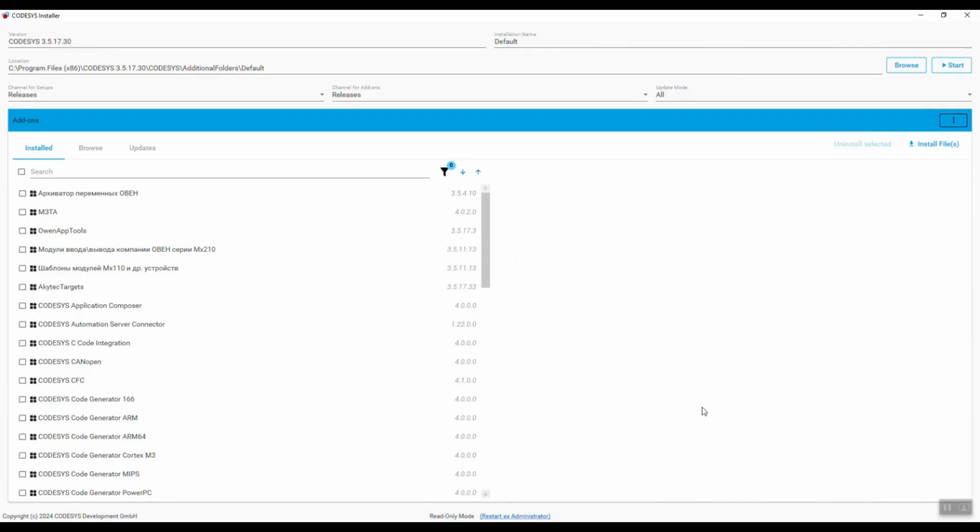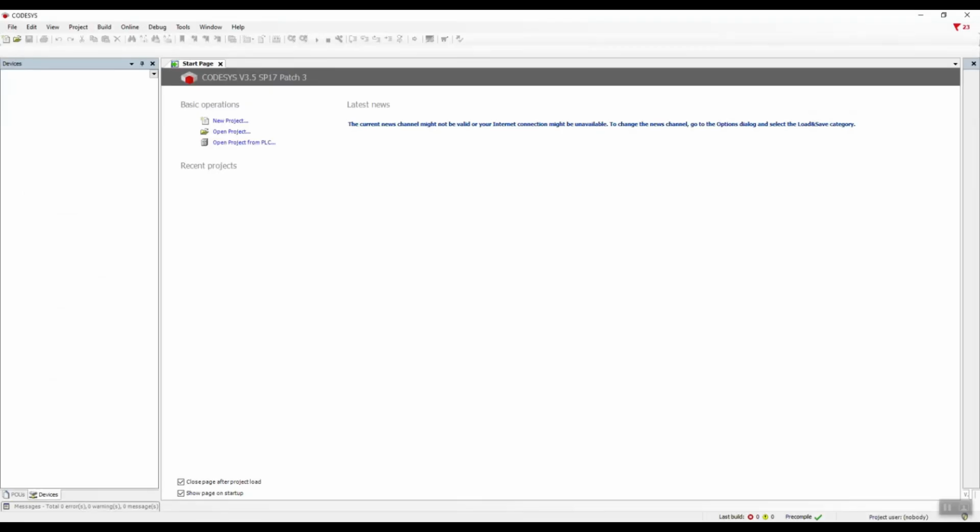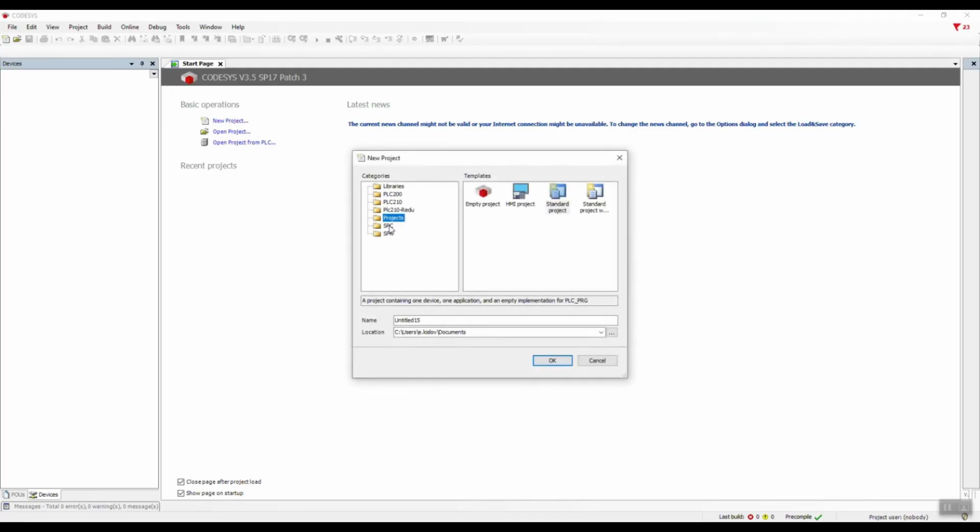Similarly, install the akYtec MX210 templates package to support MX210 modules in the CODESYS environment. Step 4. Open the CODESYS environment and create a project from scratch, just like in our first video. Select the SPC210 modification.